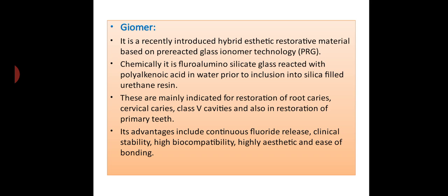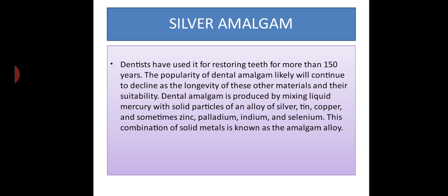The advantages include continuous fluoride release, clinical stability, high biocompatibility, high aesthetics, and ease of bonding. Now come to the silver amalgam. Dentists have used it for restoring the teeth for more than 150 years.